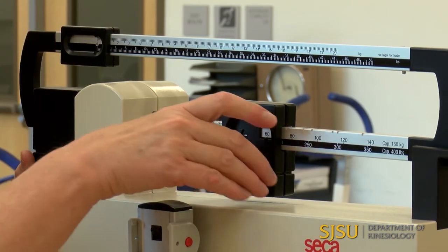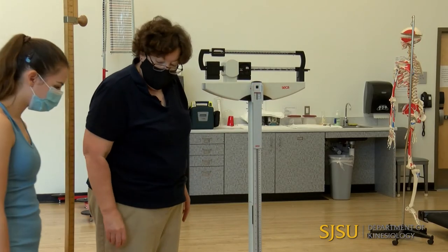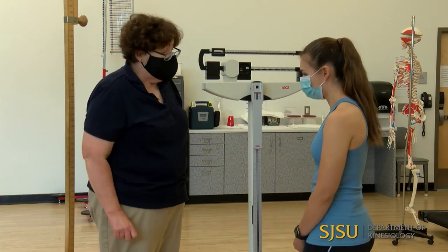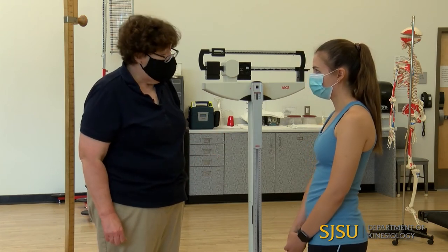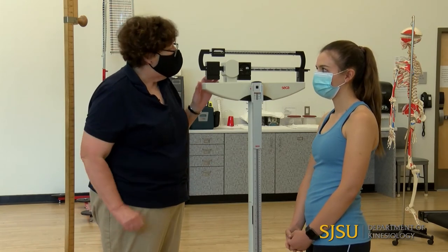Christina's going to have shoes off. If she had a sweatshirt or coat on, we would take that off. Any extra weight — cell phone, things like that — should be taken off. A watch or little earrings are fine. Mr. T-type jewelry, not okay.